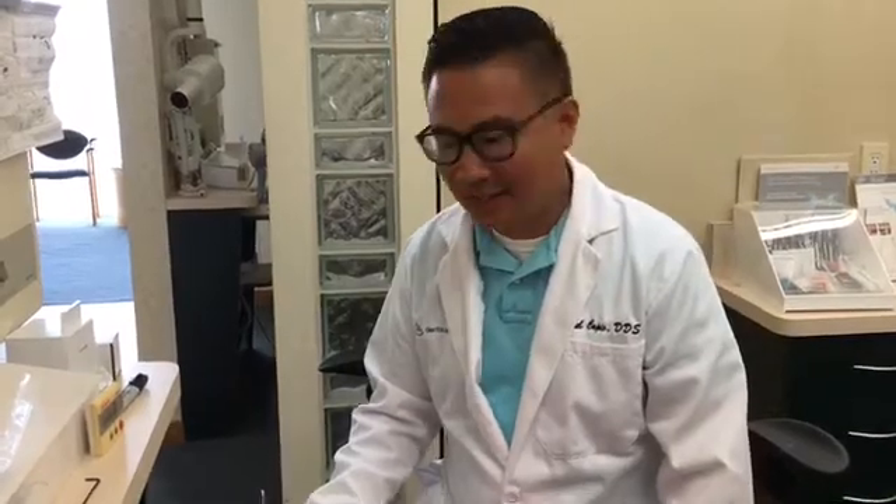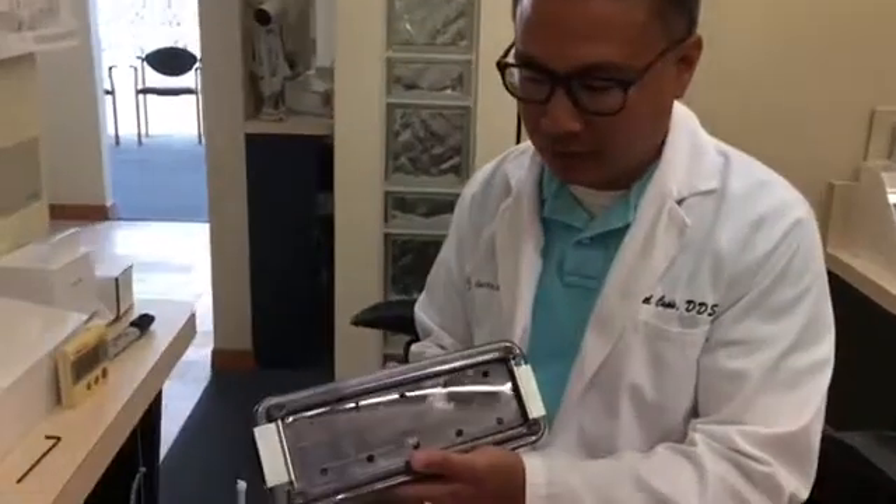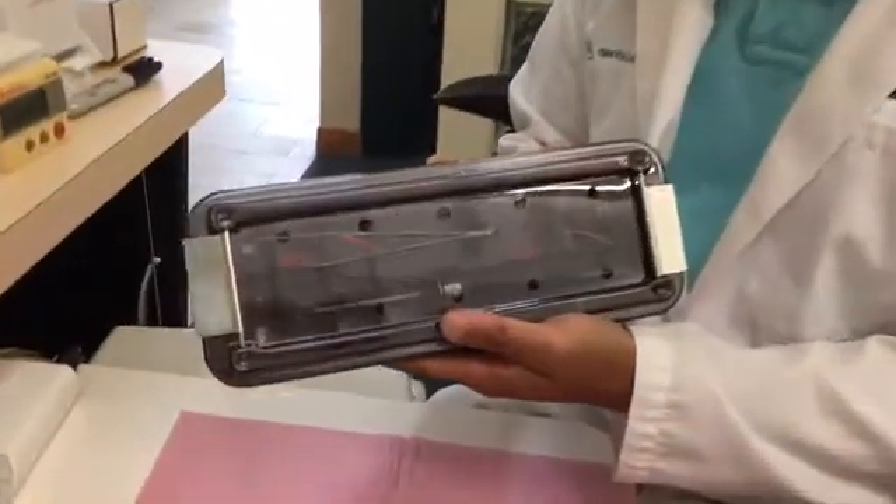Hello, my name is Dr. Michael Capio and I'm from Dental Solutions in Los Angeles, California. I'm here today to show you how to use the BioHorizons AutoTac Kit.